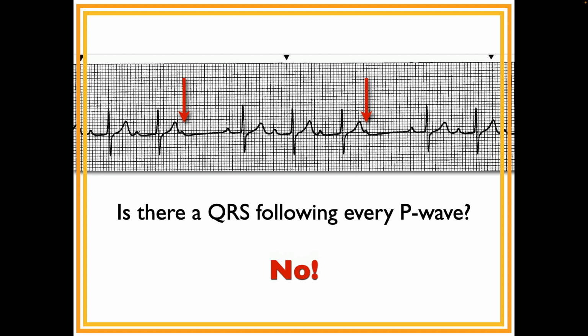So that's another reason: it looks like the other P waves. It doesn't look like a U wave. And then the third answer, which will make no sense to me right now, is a form of an AV block, till we get to the AV blocks. If you take your calipers and march off the P waves, including the orphans, what you're going to find is they march out.